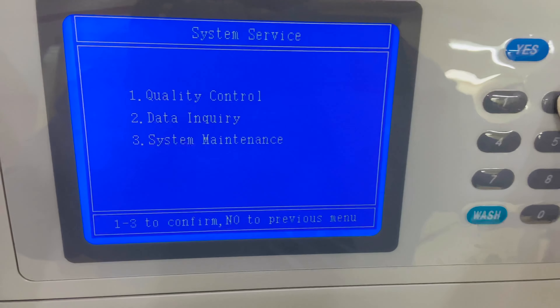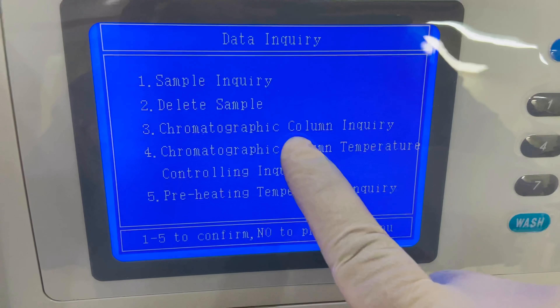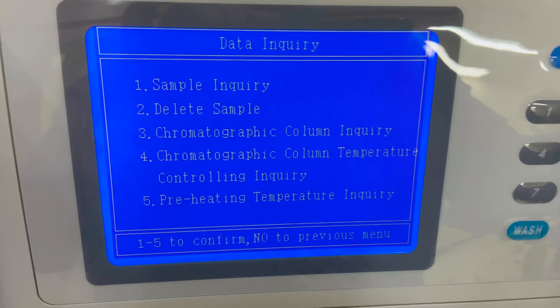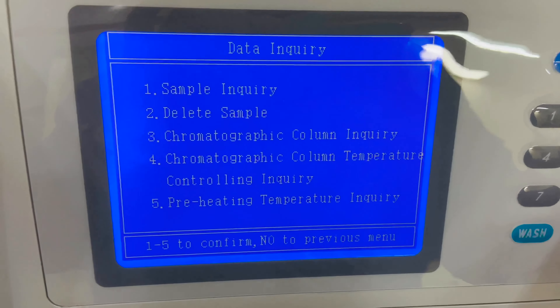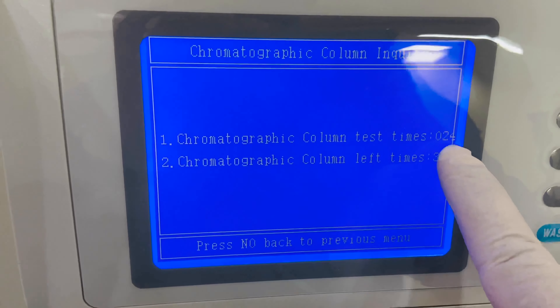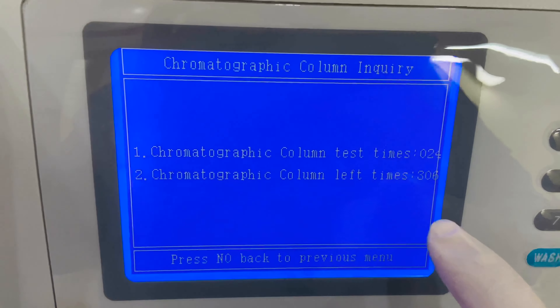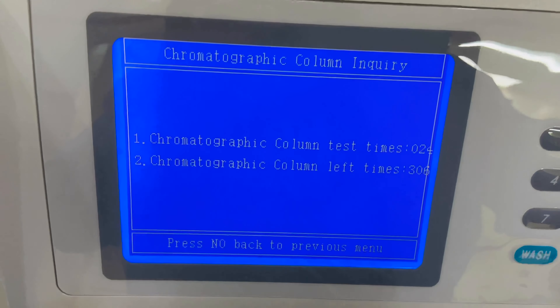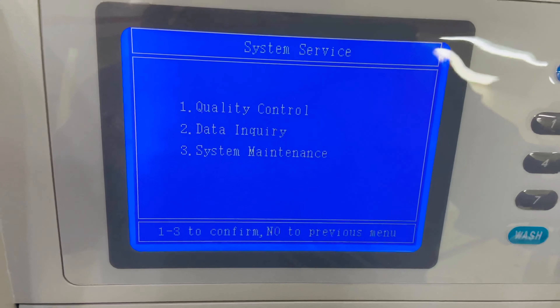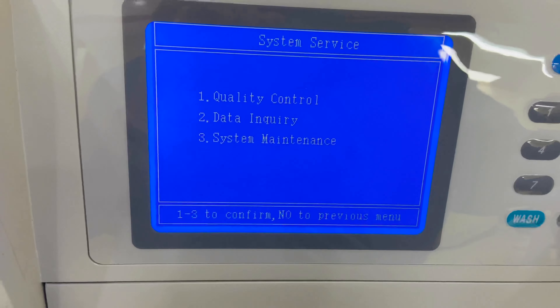Option five is 'System Service,' which includes quality control data inquiry and system maintenance. Under quality control, you can analyze data and view QC statistics. Under data inquiry, you can check sample results, delete samples, and see how many tests remain on the chromatographic column.